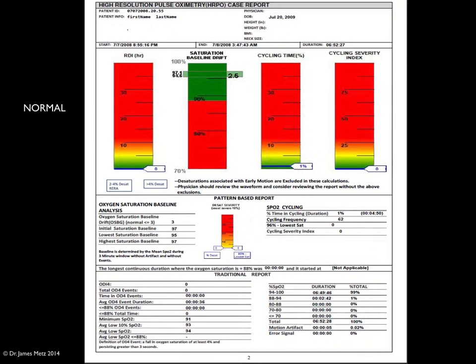So this is a normal, all in the greens. And this is a lot of times a TMD patient, but they'll have very similar symptoms in the beginning. Everybody should be referred. To be pretty honest, I'd be glad to talk to you more about this, but that's a problem. When they're exhibiting sleep apneic symptoms, they need to be diagnosed by a sleep physician.